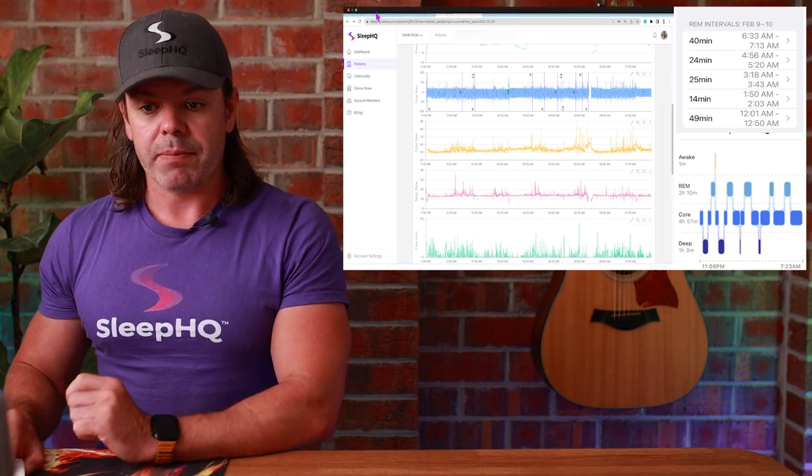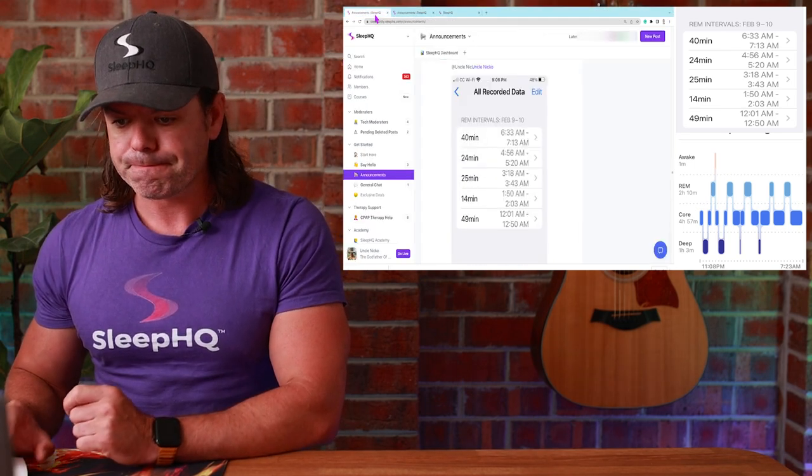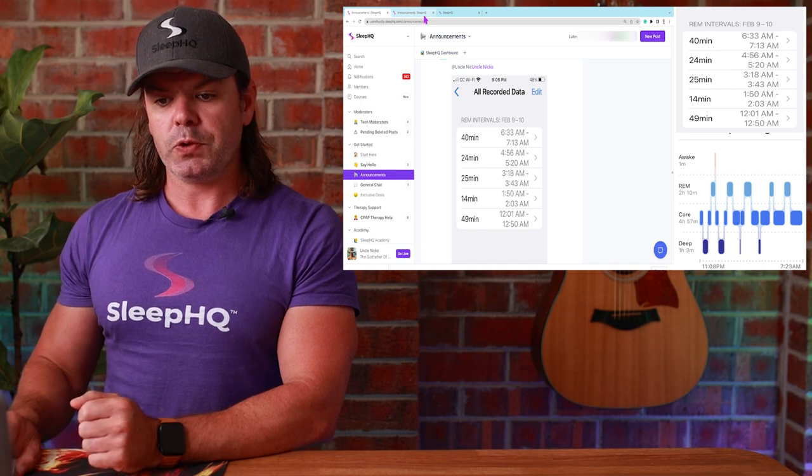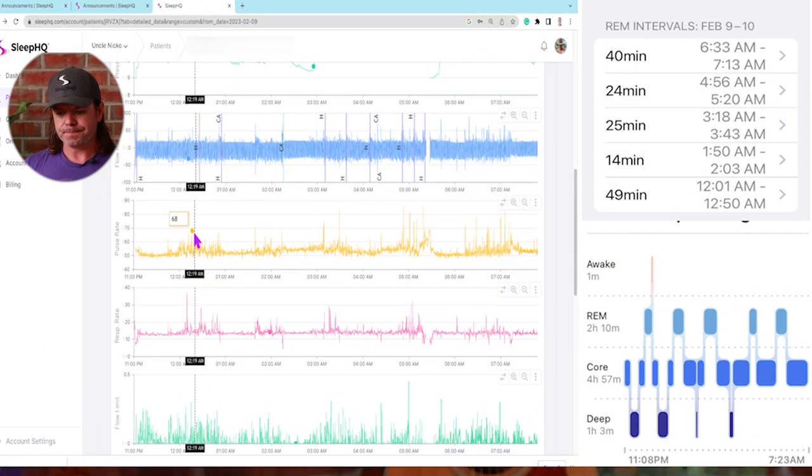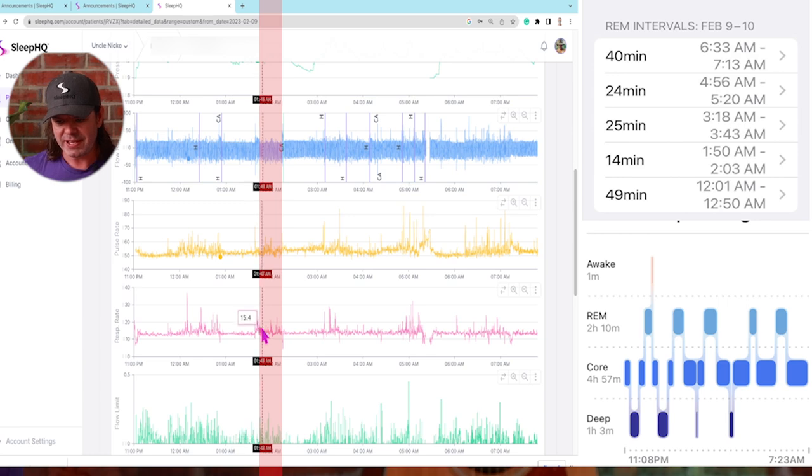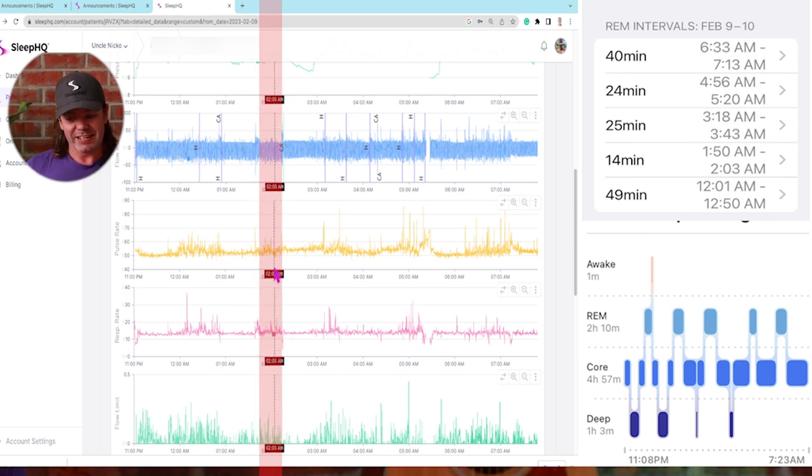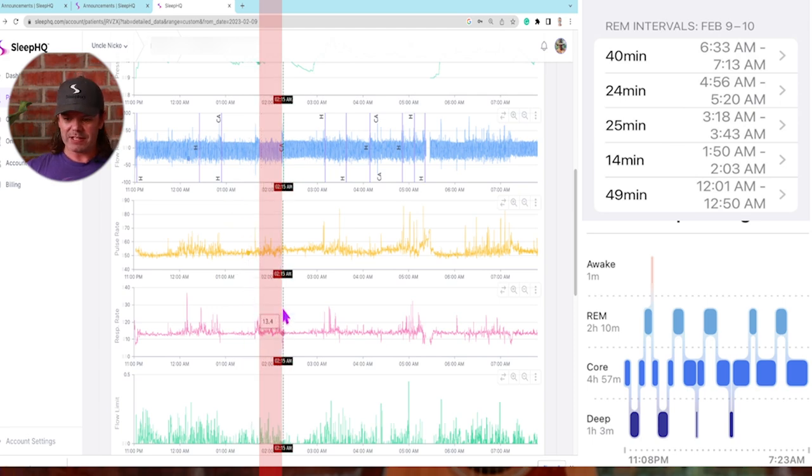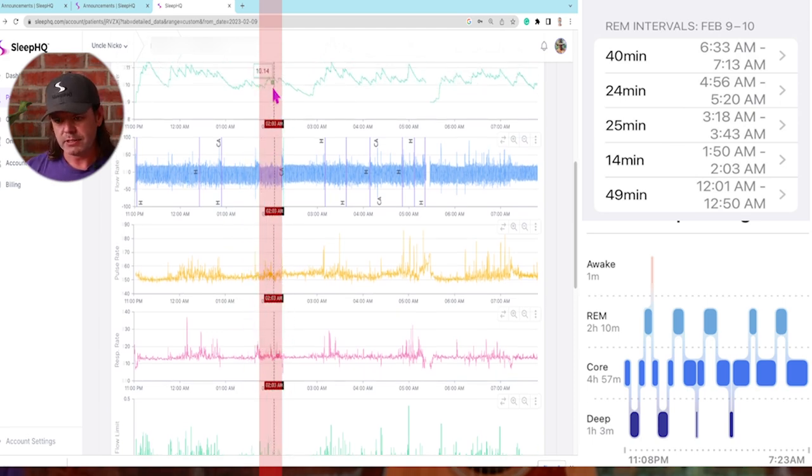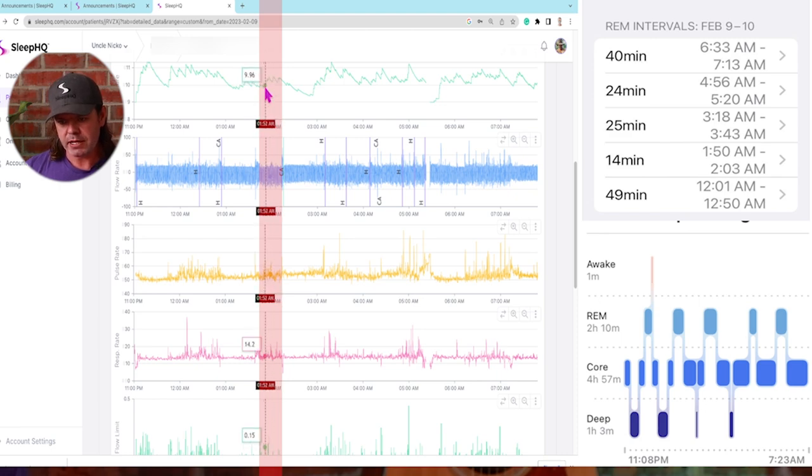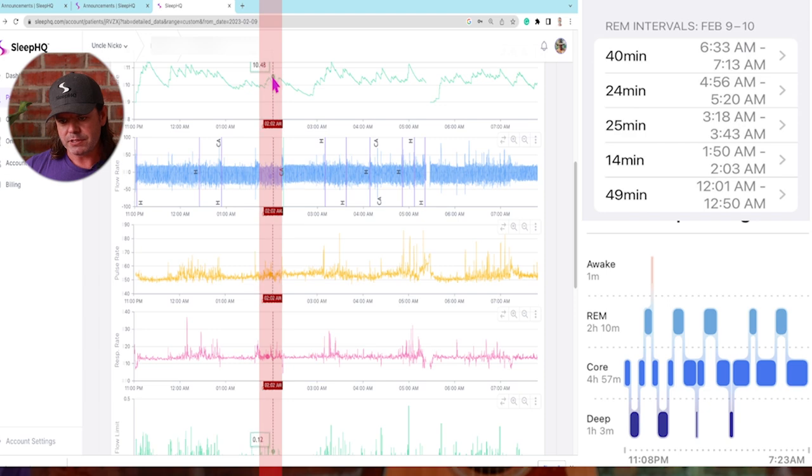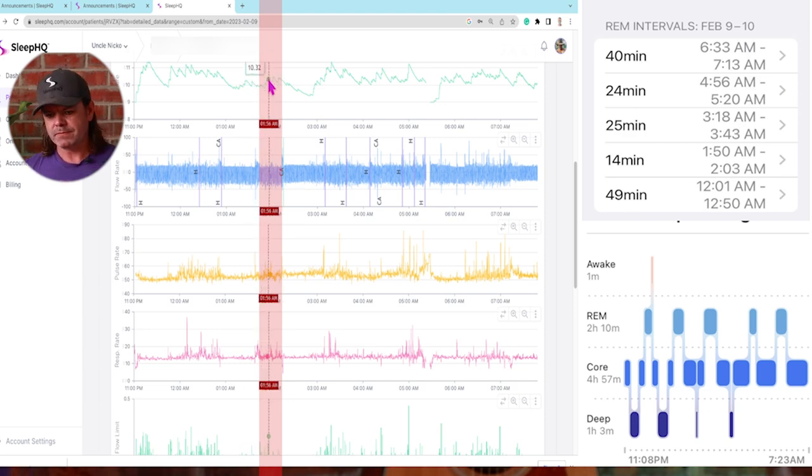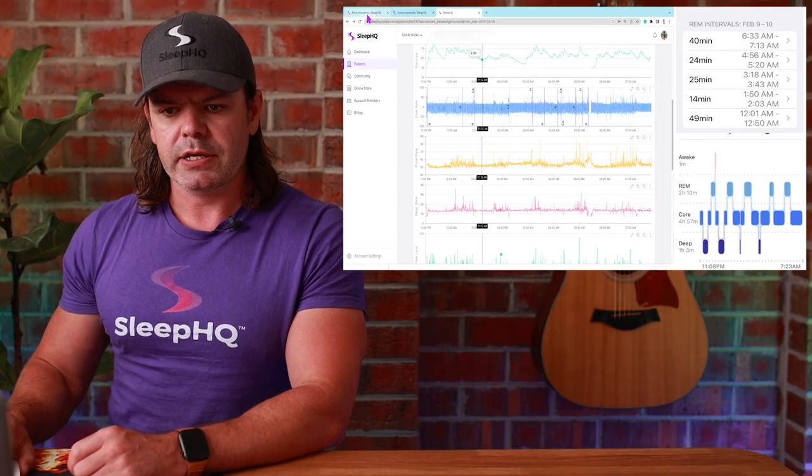Let's check out number two REM period. 1:50 to 2:03, where's 1:50? There's 1:50 here to 2:03, here. You can see once again, same thing as last time. Let's see what happened with the pressure this time. Nothing really too much happening with the pressure there. You can see an increase from nine up to 10.48. So it has increased during that period. Nothing too bad though.